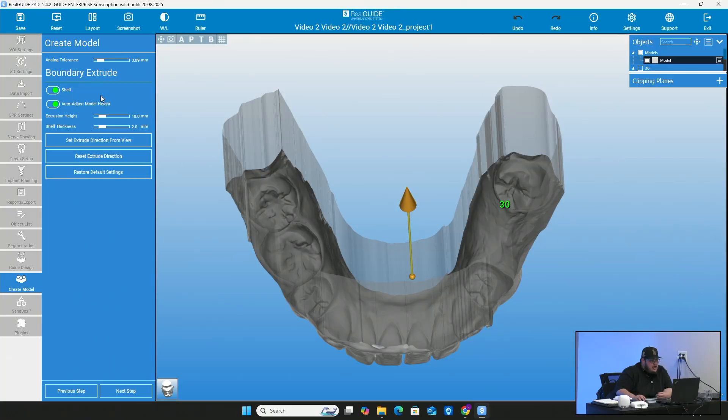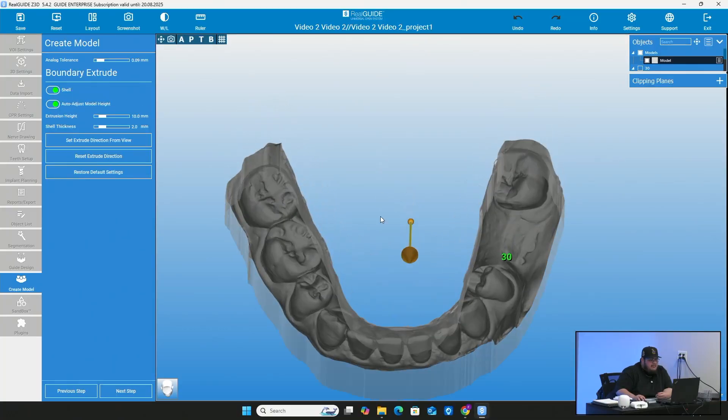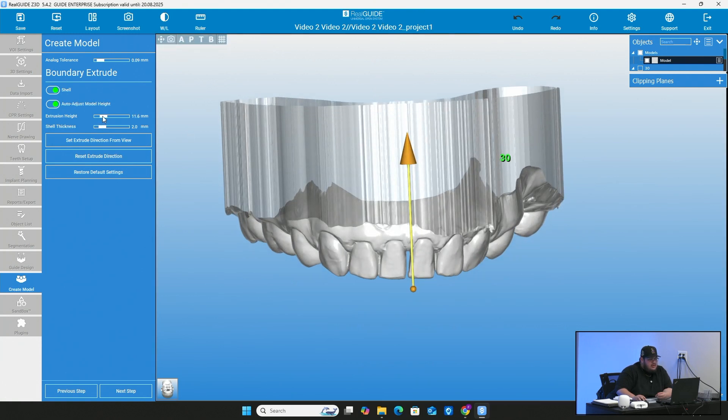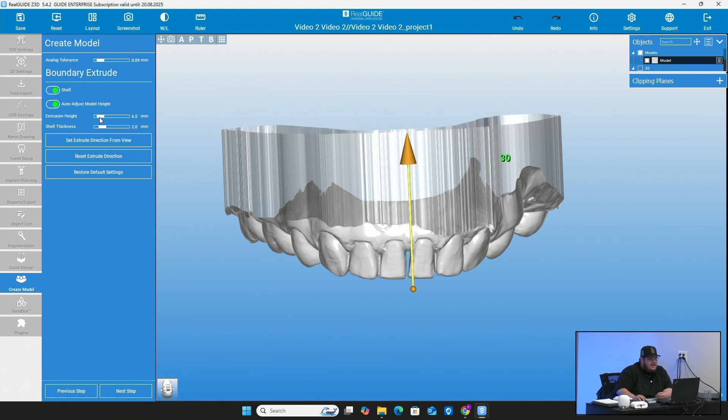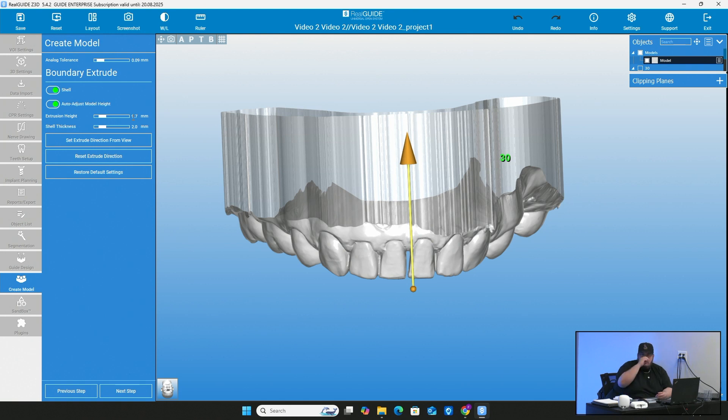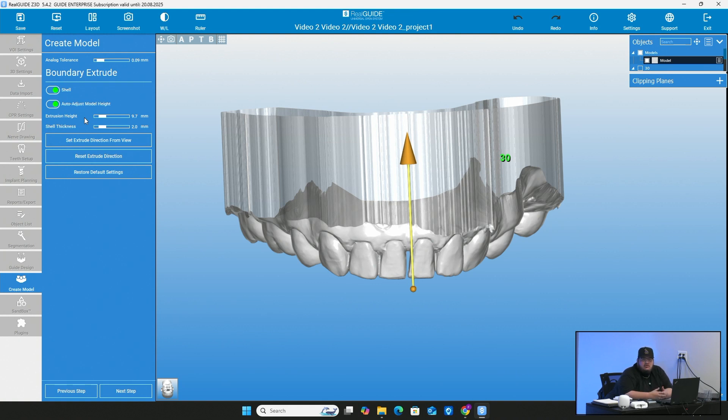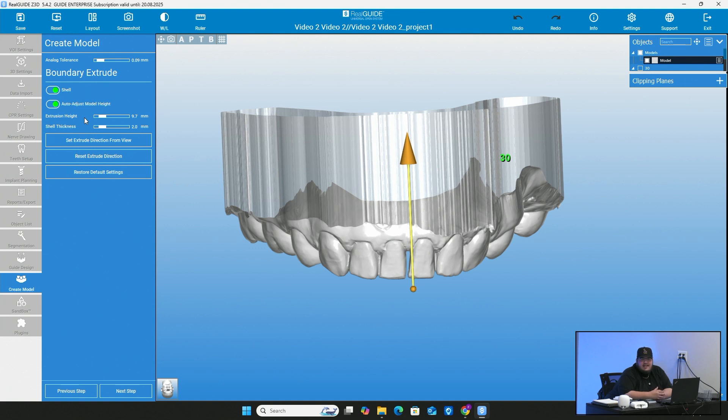And then of course, auto adjusted model height. This you can definitely have that on and it will just adjust this model height. But you can obviously come here to where it says extrusion height and edit it. If you're going to be doing a model like this where you're going to be putting an implant analog, you're going to want it to have some length to it just because you are putting an analog in there and you don't want the analog to stick to the bottom or anything like that. So you want to make sure that your base does go a little bit longer than that analog. I put it anywhere from eight to 10.